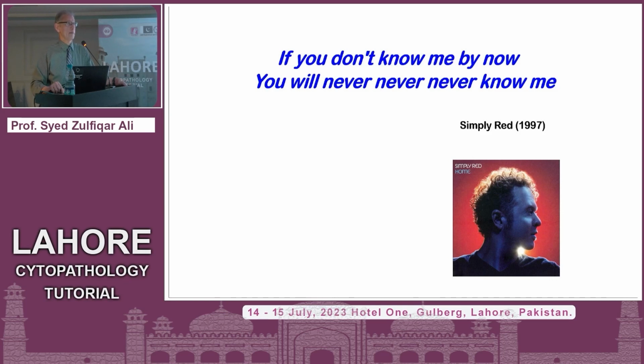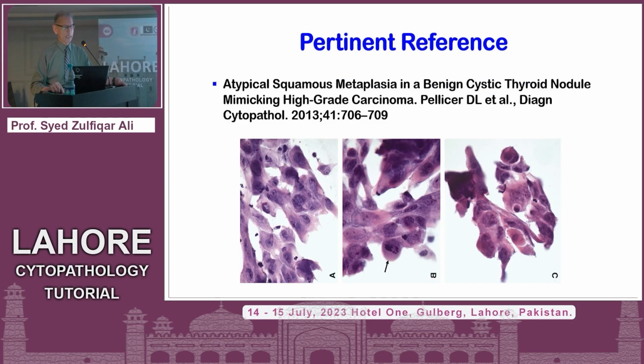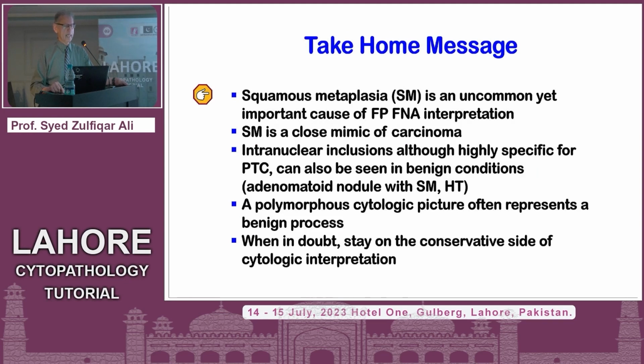And that is squamous metaplasia. We know it's a pitfall in GYN pathology. It's a pitfall in lung cytopathology. It's a pitfall in salivary gland cytopathology. And now we know it's a pitfall in thyroid cytopathology. So know to recognize the features of squamous metaplasia. And once again, there are published series, and this one published from the Harvard group showed even more atypical looking squamous cells here. It will be very hard not to consider a suspicious for malignancy or malignant diagnosis. So it's an uncommon cause, but it certainly is a potential cause of false positive diagnosis.